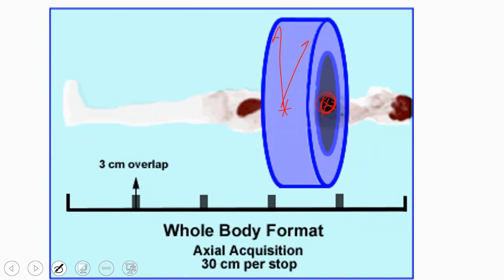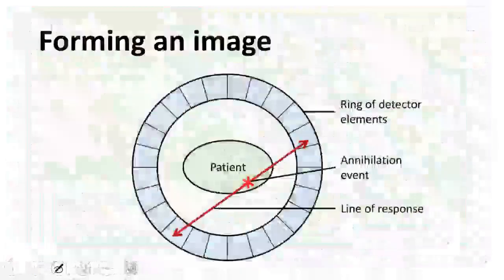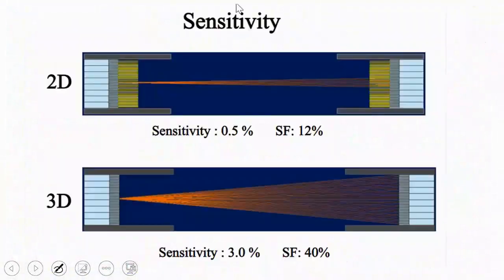If it is at the edge, the effect is lower. In the patient's field in the Z direction, it is the same relative to the center, but with lower sensitivity. Briefly, at the edges, the resolution decreases. Why does the resolution decrease? Because of the crosstalk issue I was talking about earlier. These are the parameters that affect the topic.